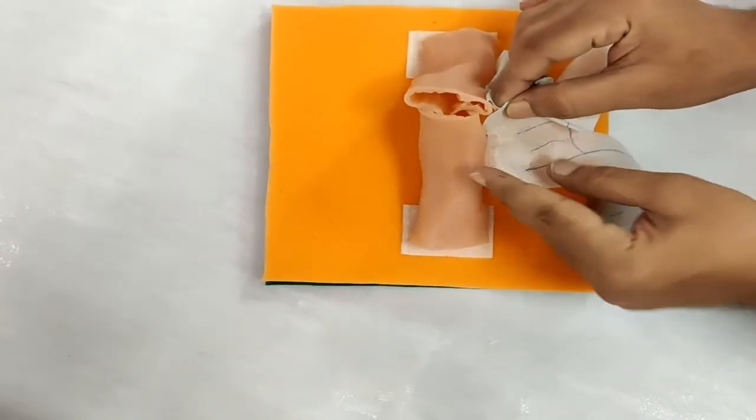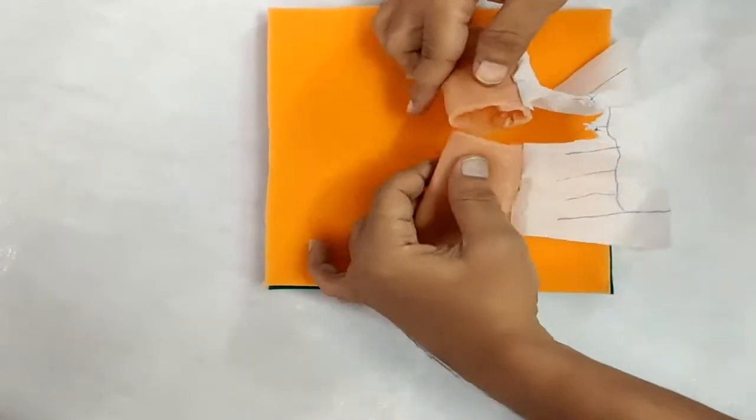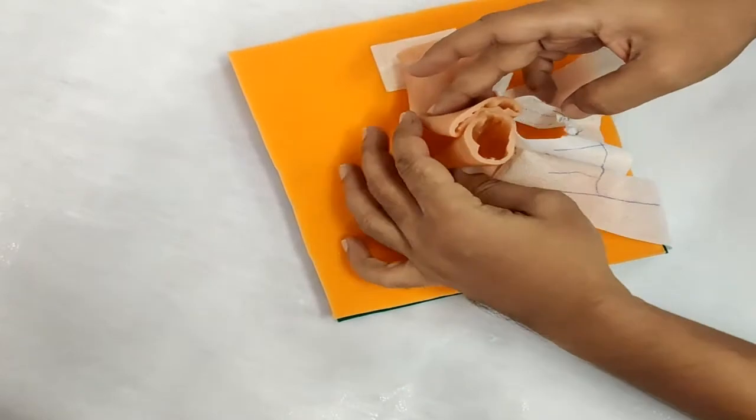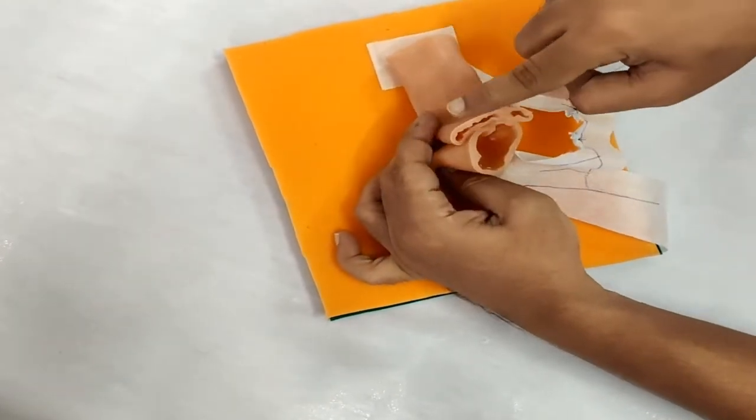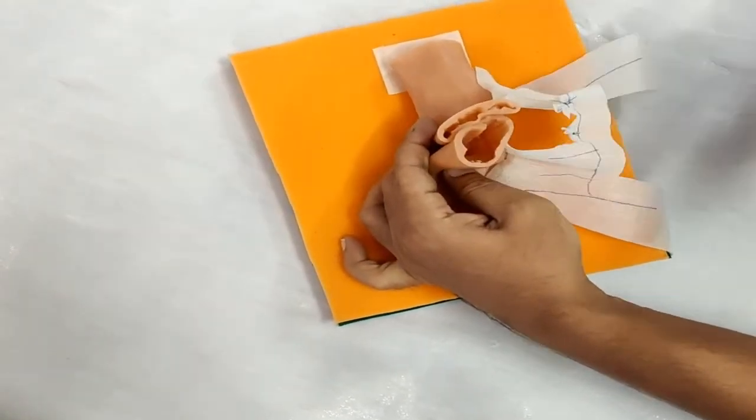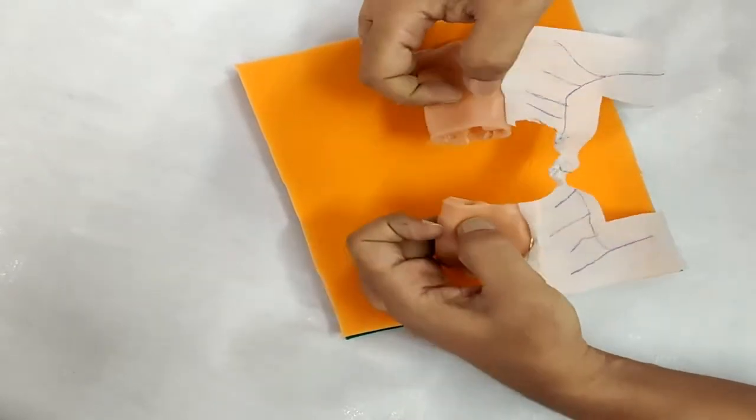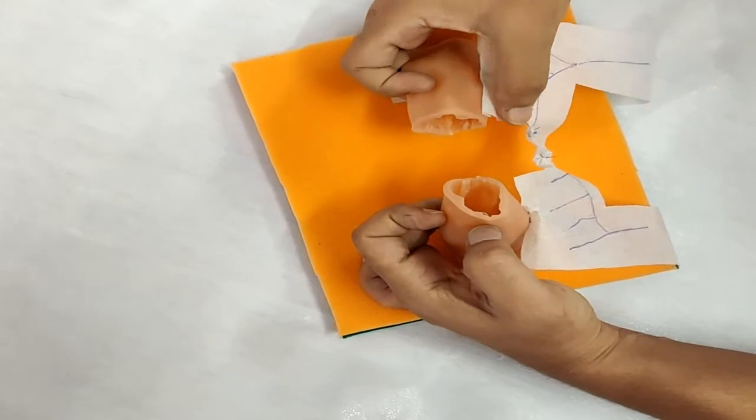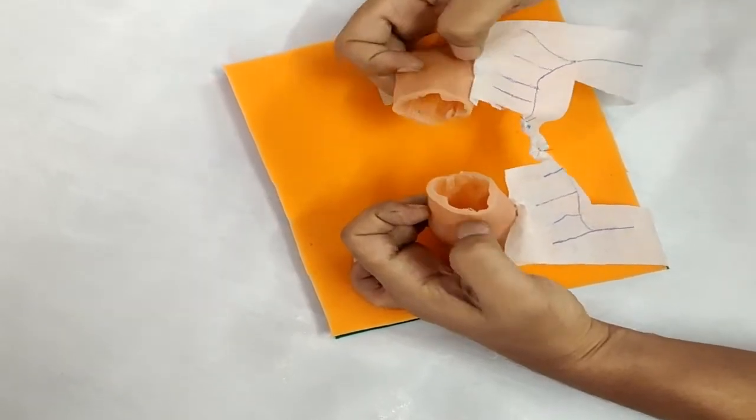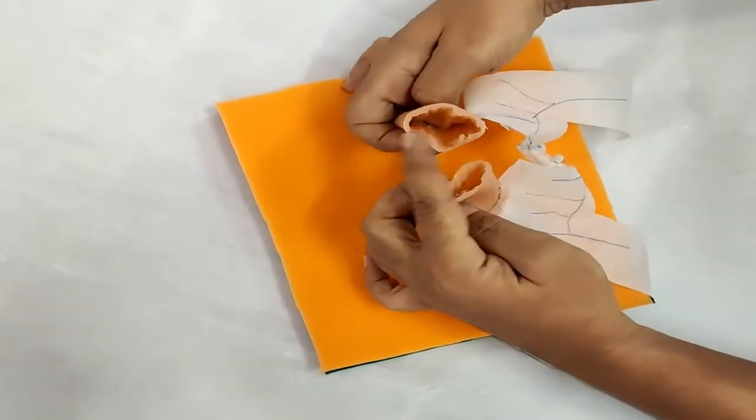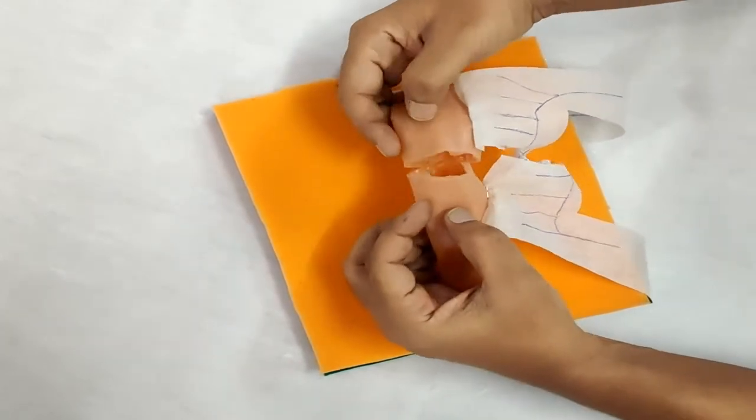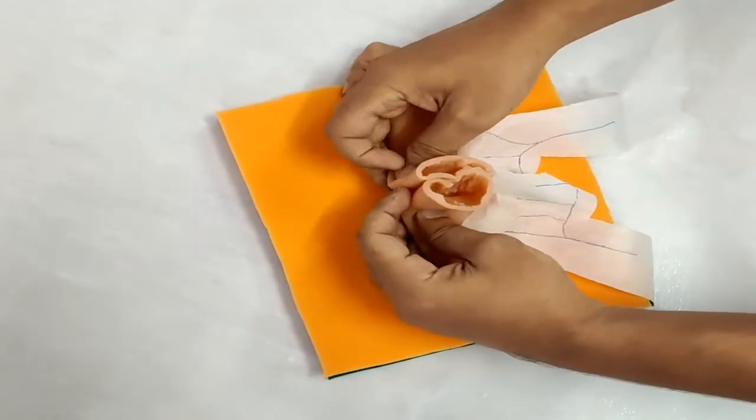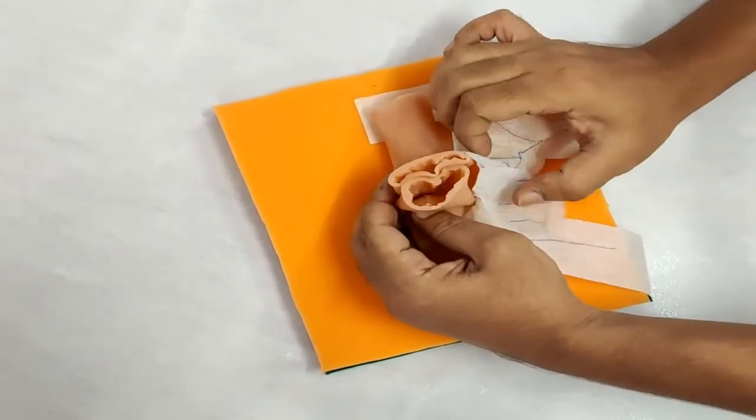Third thing you need to make sure is that there is adequate blood supply from the cut ends of the bowel. This is important because in many cases what happens is that the blood supply to the cut ends is damaged while cutting the intestine, creating an avascular segment which will not heal properly and probably give you a leak after anastomosis. So now we will start with the basic principles of anastomosis.